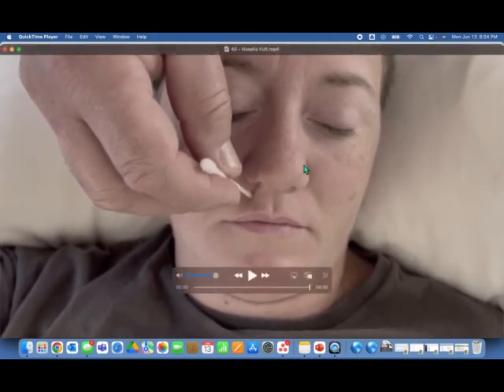So nasalis, this is the place that I've selected for needling nasalis, because it does extend distally this far, but it does comprise the lateral aspects of the nose as well. It could be needled here, but probably not very tolerated in this area, so we've chosen distal to that for patient comfort.